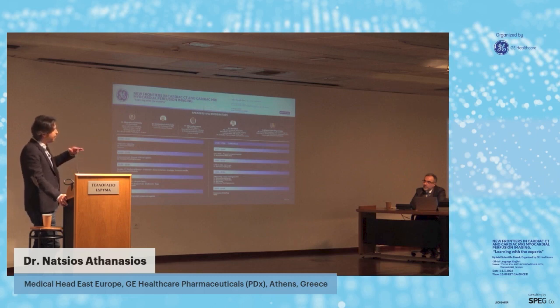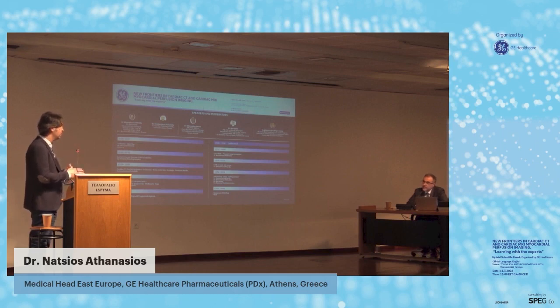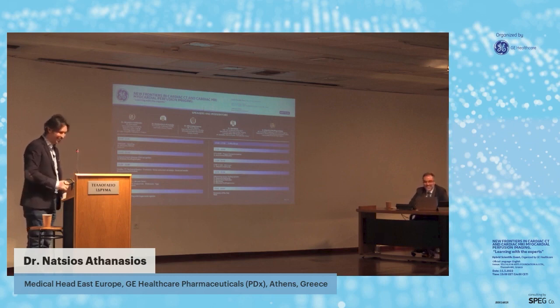As we have a more advanced stage, a higher probability and a higher age, we can proceed with stress perfusion techniques, stress imaging techniques. But if the clinical symptoms and all the signs are very indicative of coronary artery disease, we proceed with coronarography. I think this is the general point. It has to do with the pre-test probability, and we have to choose the safest test. If we can have an answer with only one test, that will be preferable in order to get to Ithaca faster.